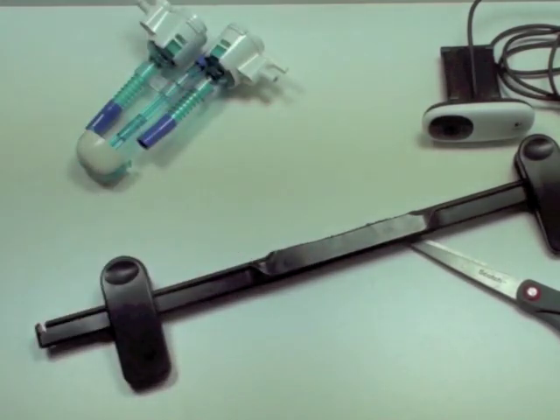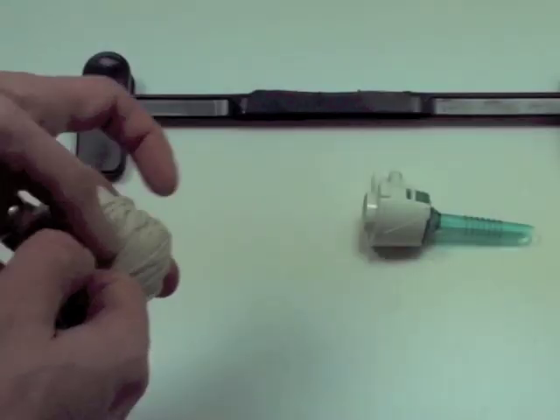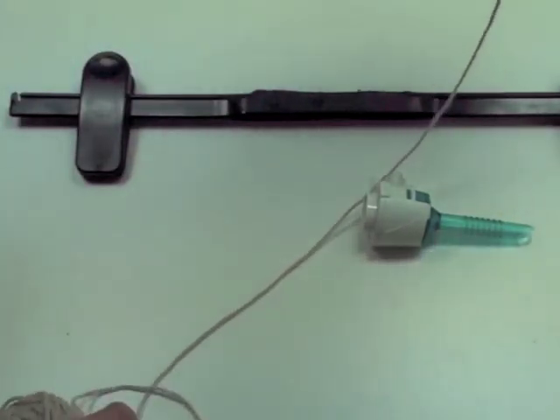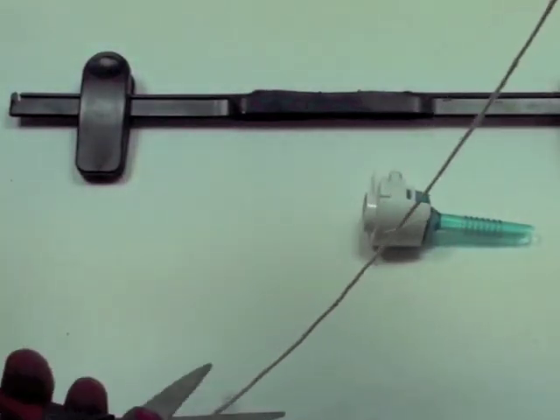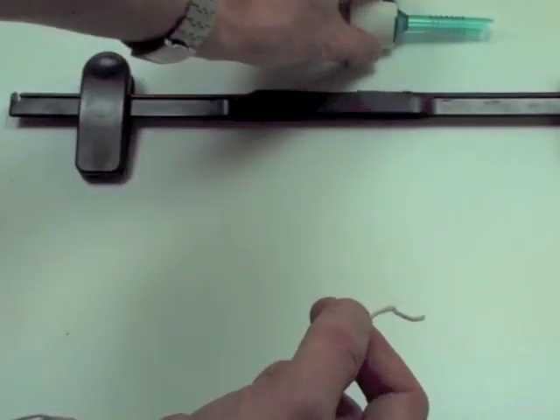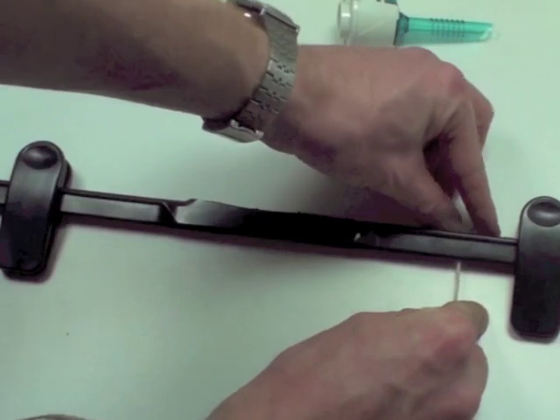Next step is take a bit of string, and what you're going to be doing is cutting two lengths of it so that you can lash the trocars to the top part of the pre-cut skirt hanger.